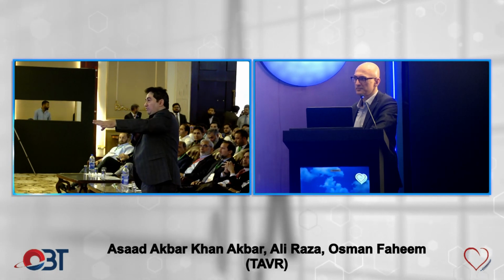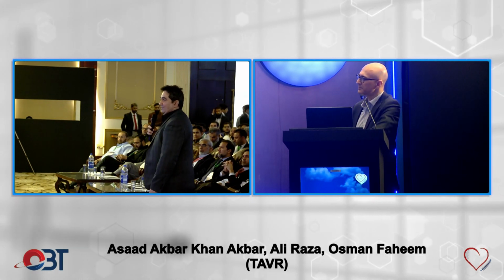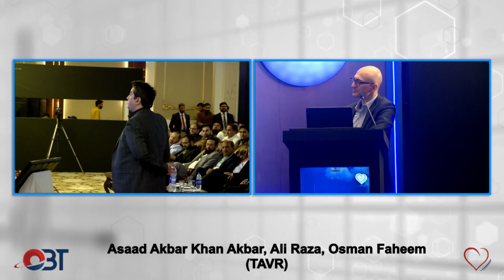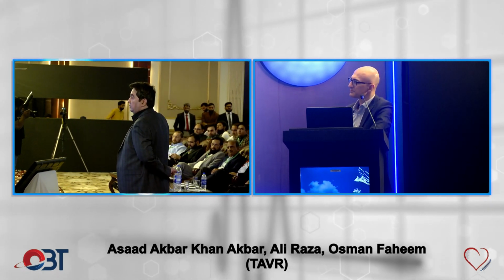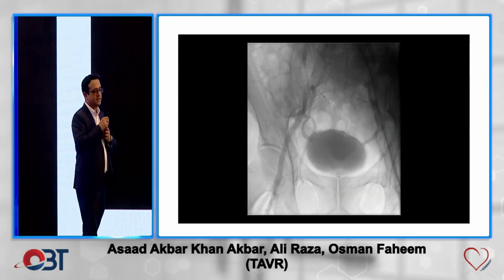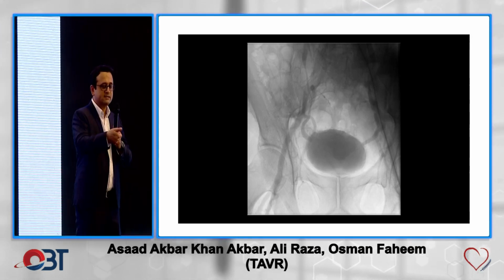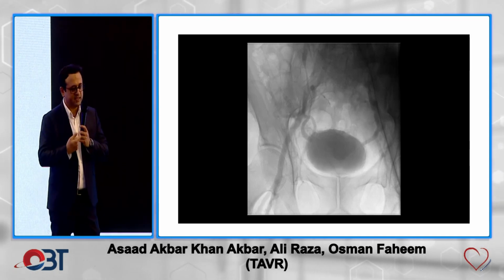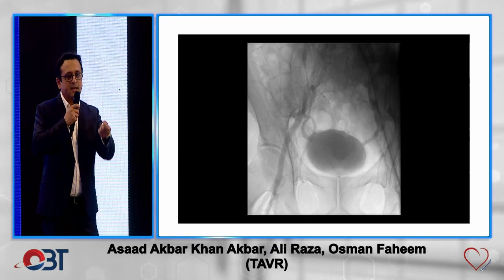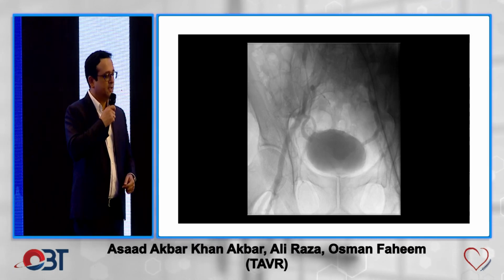The next question, wire selection. I think we do 99% of our cases with Confida. Yesterday we explained it in the training village as well. When I started doing it in late 2014, these Confidas and Safari wires were not there, which were preformed. We had to make these bends, and I was telling them yesterday that I was a fellow, and the fellow's job was that the consultant would make the bend and give it to you, and we were just pressing it for 5 minutes to make sure that the bent part, which is going to hit the ventricle, has no actual spicule in it pointing out because it's a man-made bend.